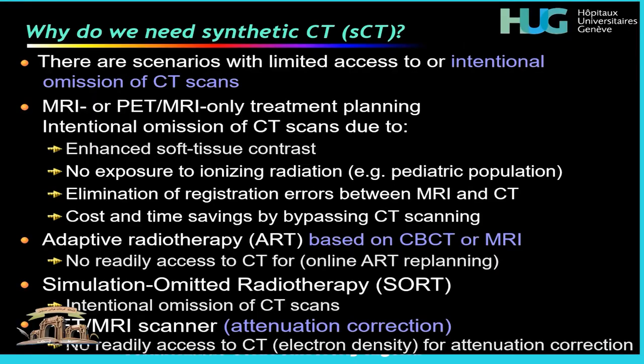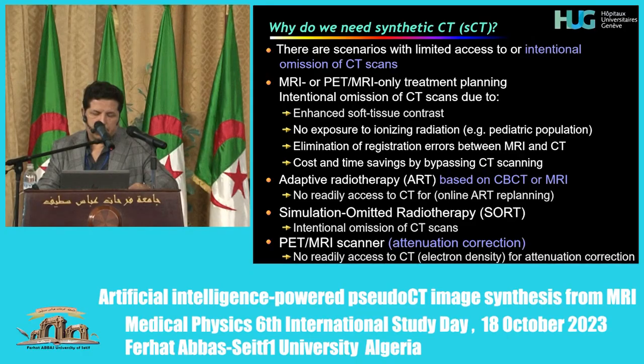This is a concept that I learned from the literature called simulation-free radiation therapy. I come from the nuclear medicine field, and this is something that we got used to in the collaboration that we have with the radiation oncology department. Something which is closer to my heart is PET-MRI, where again we need to generate an attenuation map that we can use for attenuation correction purposes.